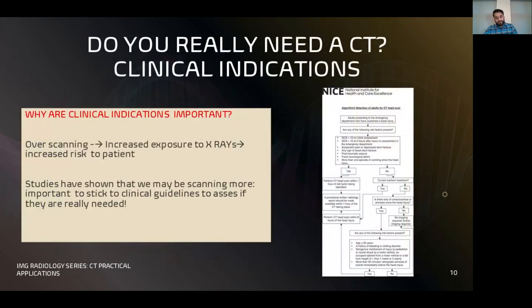So we're going to talk about the indications, or a little bit about indications. Do you really need a CT? Because a lot of research shows that maybe we are overscanning. Maybe we are doing too many CTs and x-rays and other scans as well. Why is that a problem? The problem is that we expose patients to a lot of radiation when we do CT scans.